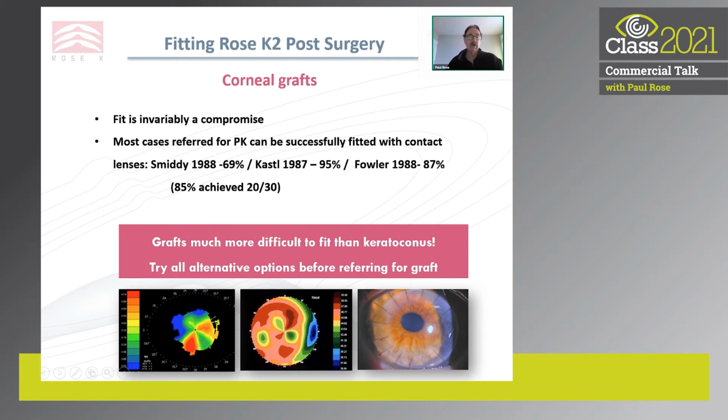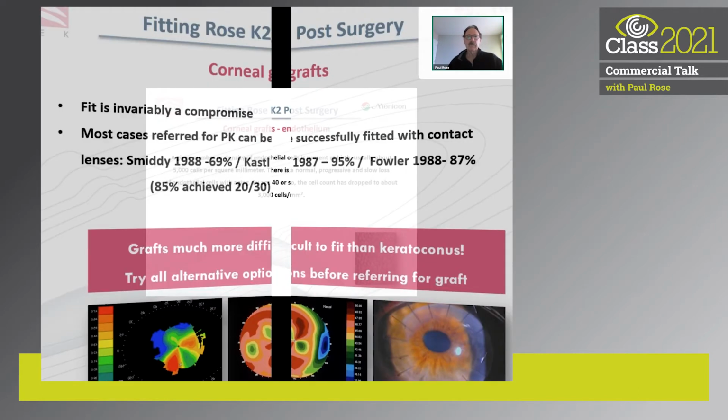And it's very interesting to see the graft numbers in the world going down. In New Zealand here, they're under 50% of what it was about 40 years ago. So we're continuing to see designs getting better, materials getting better, manufacturing getting better, and we're able to keep the majority of patients without needing a graft in their lifetime.